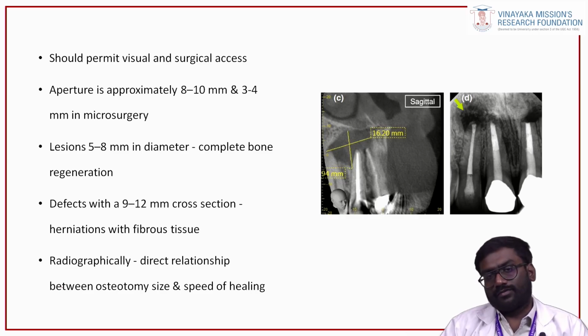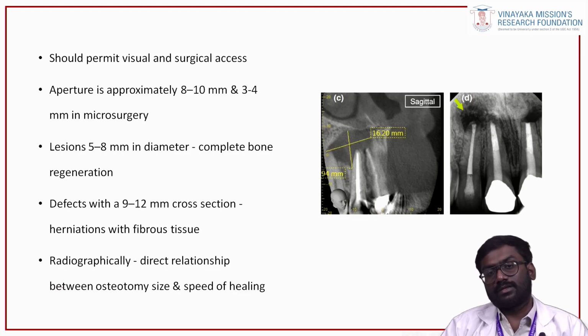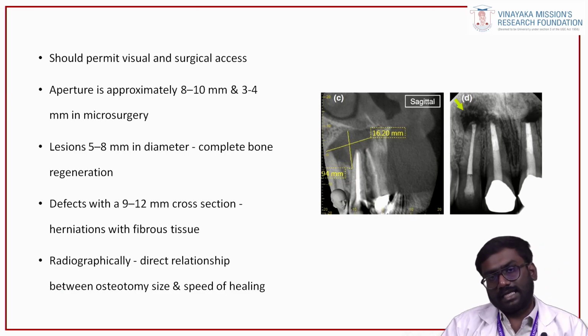When I was talking about the flap design, I asked you to make a wider flap, and healing is not going to be hampered. But when you create a window, keep in mind the size of the lesion that you have determined from the preoperative radiograph. Create an adequate size of window alone, because if the defect size is smaller, healing can be faster. If the defect size is larger, it is going to take a longer period.